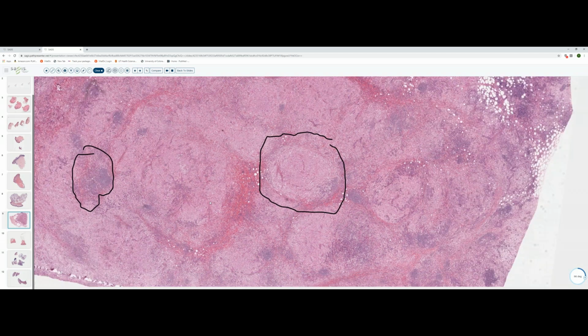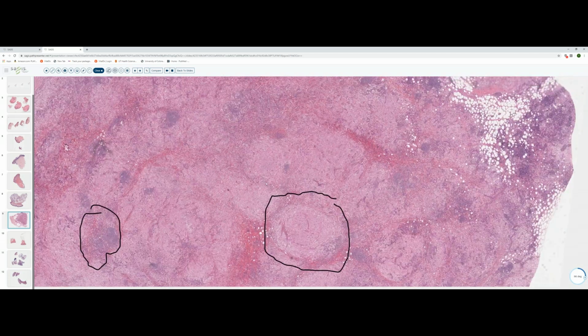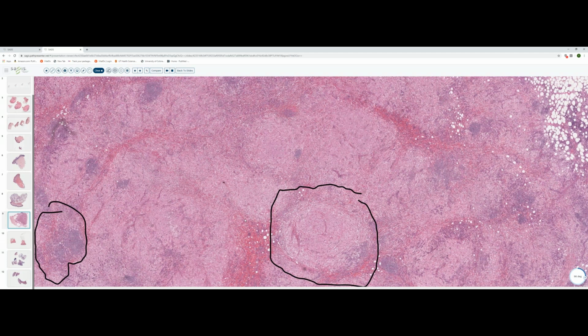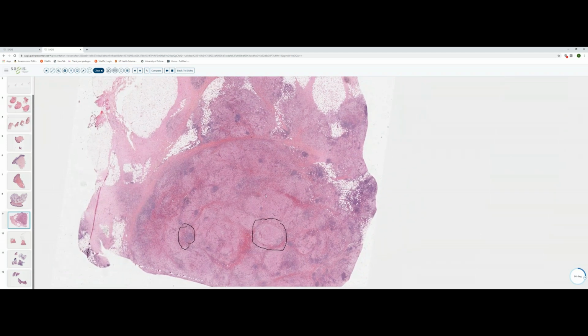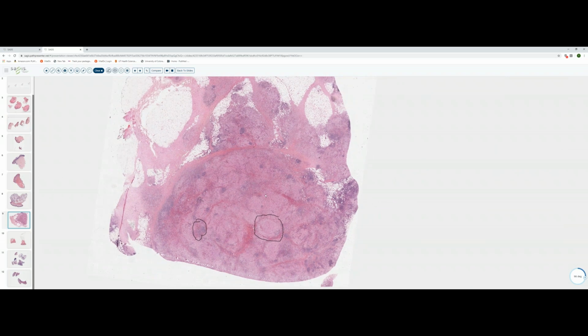And this is a very, very characteristic histologic appearance that is extranodal Rosai-Dorfman disease. And the clear staining cells here are S100 positive, but CD1a and Langerin negative. And so this, if they gave you this on boards, this would be kind of a hard slide. This is a disorder that's really kind of strange. No one knows exactly what triggers it. And the lesions are common on the head and neck.